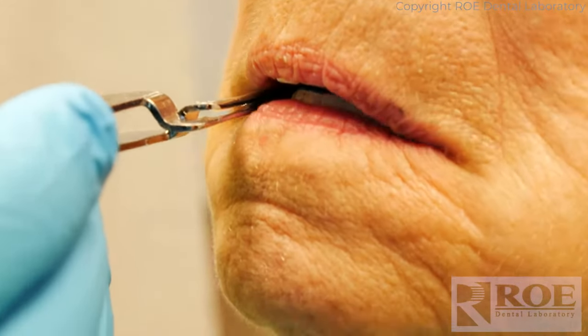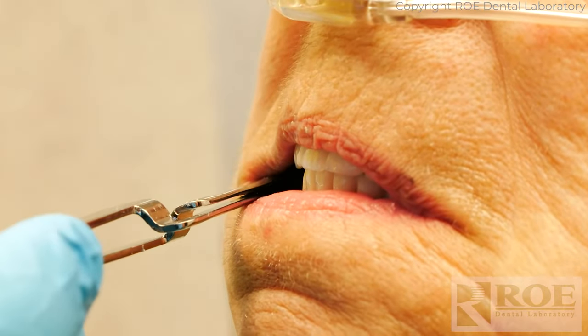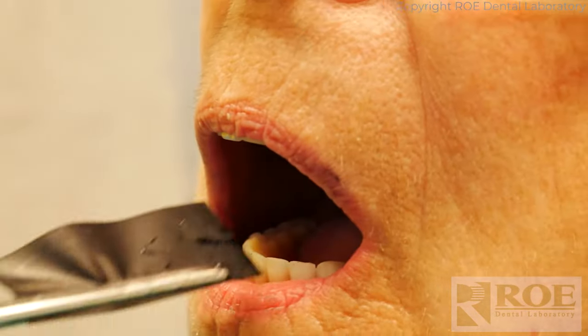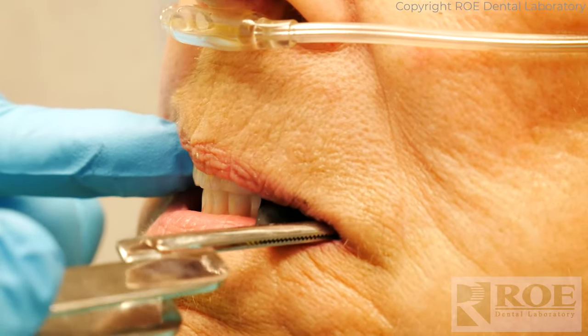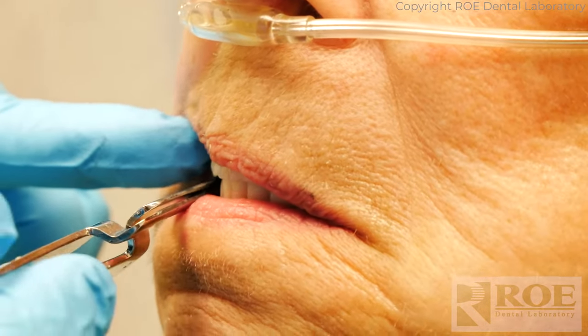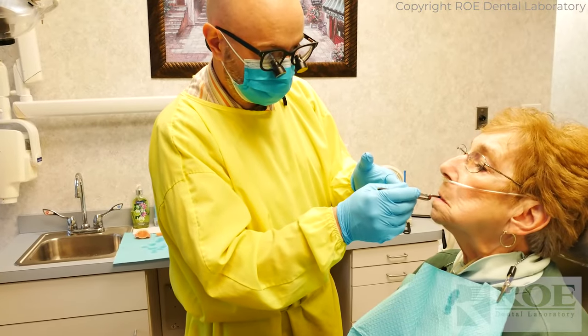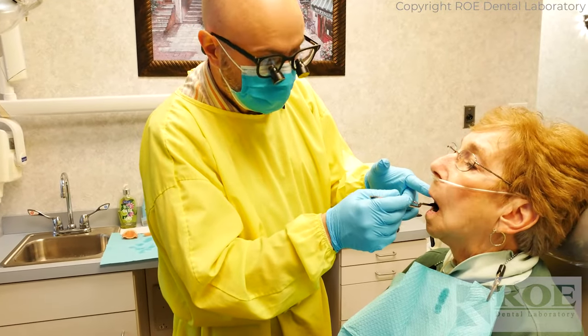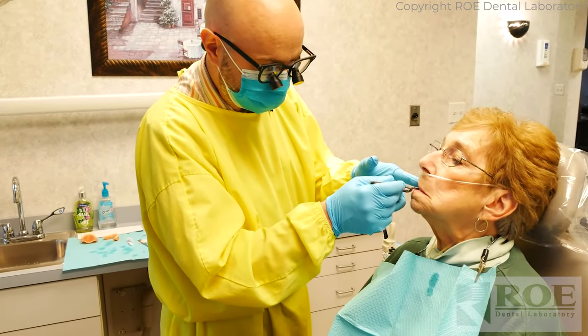Job well done. When you bite down, do you feel one side touching before the other? Can you bite down for me on your back teeth? Stay right there. Feel that? Thank you. Open for me again and bite down on your back teeth. Stay right there — feel how tight that is. Open for me again and bite down on that side. Almost the same — one more adjustment. That's the first time I felt that kind of resistance.